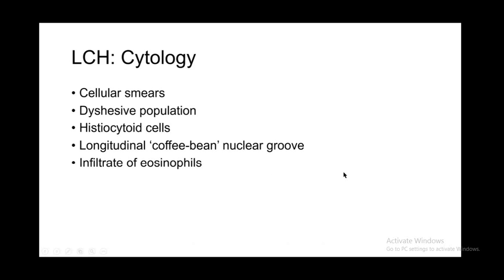LCH cytology elsewhere, when we are mentally prepared for it in a child, in a bony lesion, may be a relatively straightforward diagnosis, especially if we are aware of the cytological features. But a tumor presenting as a thyroid mass can throw off a young cytologist if this differential is not thought of.